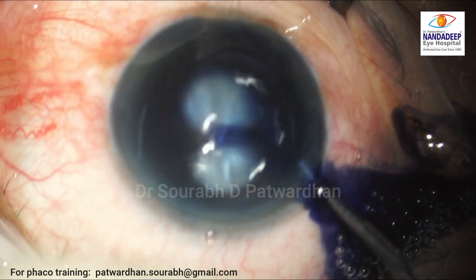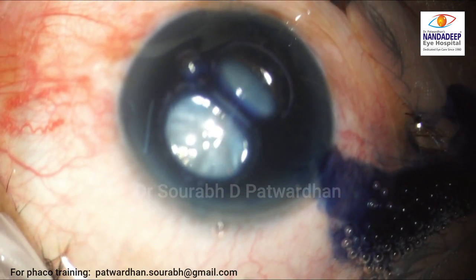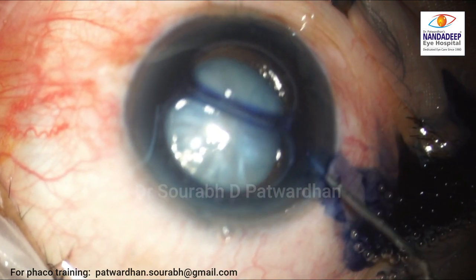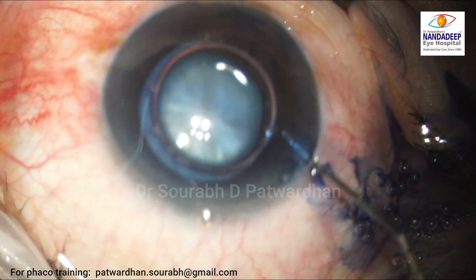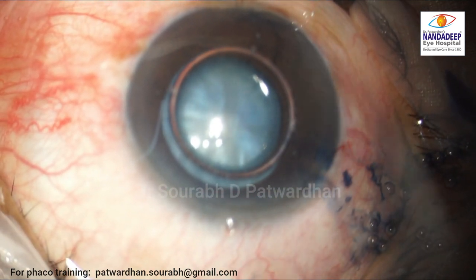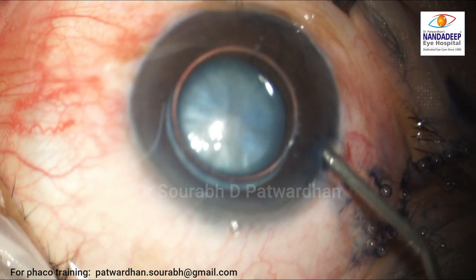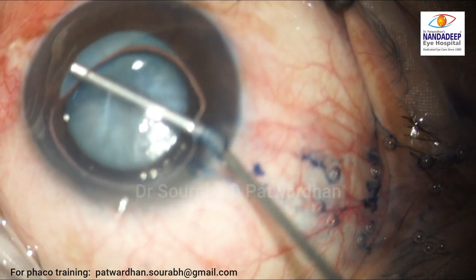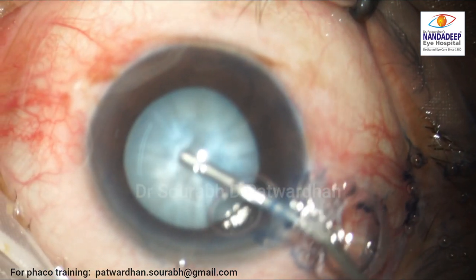A side port is made and the capsule is stained with trypan blue, which really helps not just with visualization of the capsule but also makes the capsule a little bit thicker and easier to maneuver. Methylcellulose is injected after washing out the trypan blue.